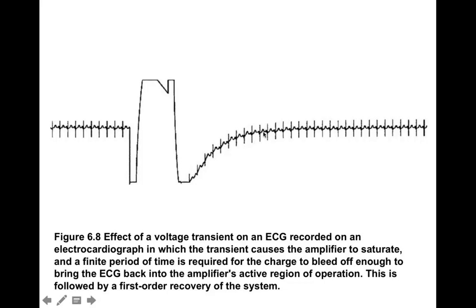We see this in the EEG lab all the time. Usually in the EEG lab, the response time of the amplifiers is faster compared to what you see here, but the saturation is occurring because of some external source. Often maybe a person sneezes, or they clench their teeth, or they generate some really high signal that drives those amplifiers into saturation.